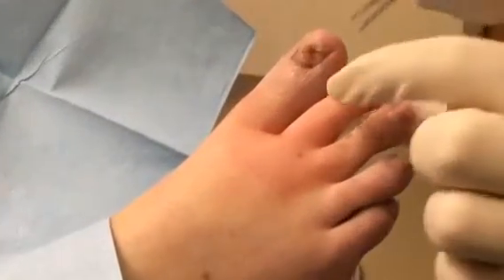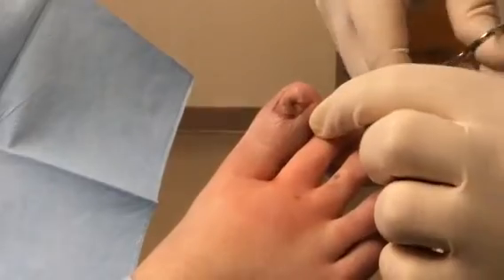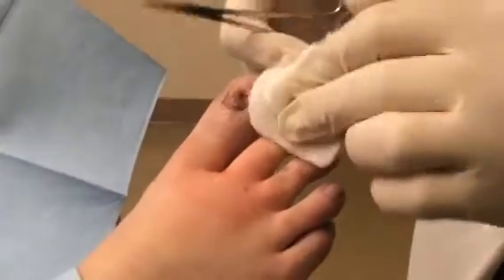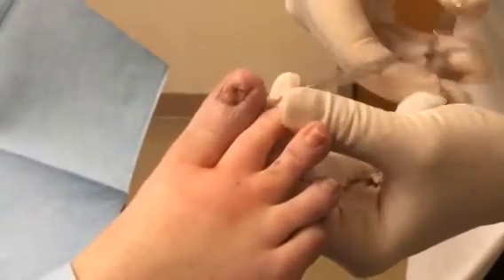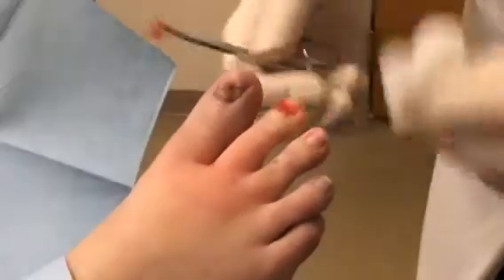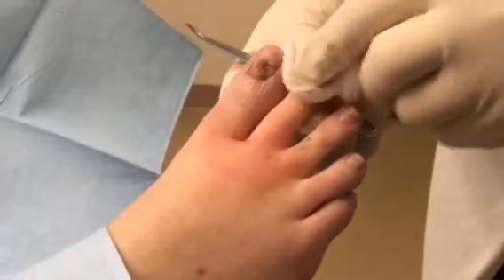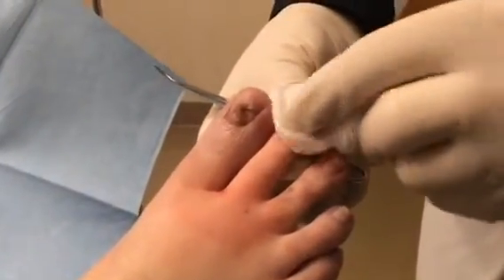This is a simple, quick procedure. The toe does need to be completely numb. Nothing is cut here. And that's the nail bed, which looks relatively normal — I don't see any problem there.